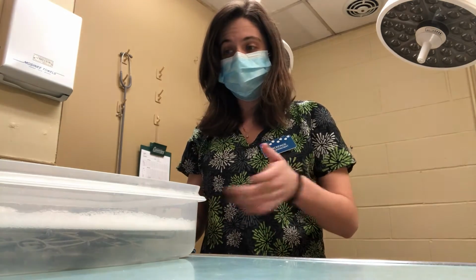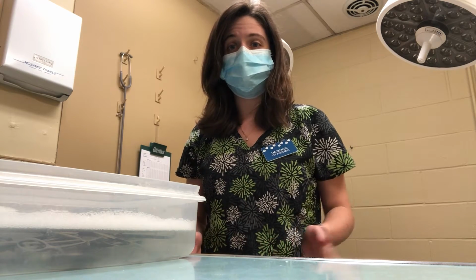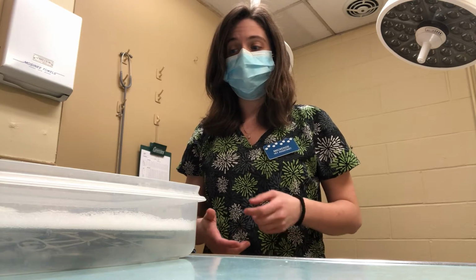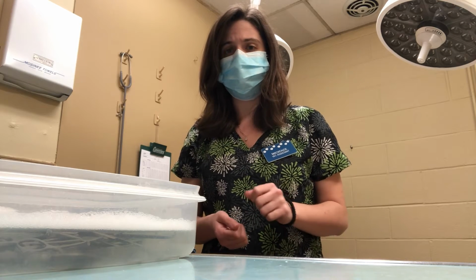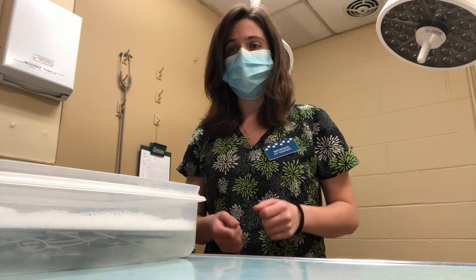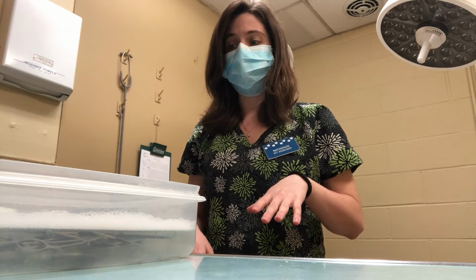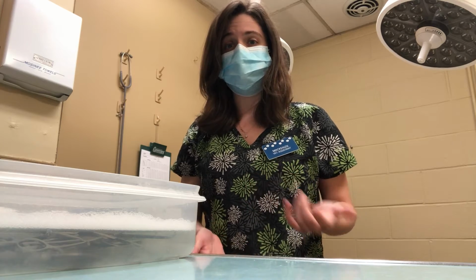In addition to using the autoclave for sterilization, after the decontamination process, some hospitals will use an ultrasonic cleaner to further the sterilization and decontamination process. And then you can also use instrument lubrication to get into the hard to reach places like the box locks and the hinges to make sure that everything remains clean. So we're going to let these soak, and then I'm going to come back and show you how to do a pre-cleaning along with our decontamination process.